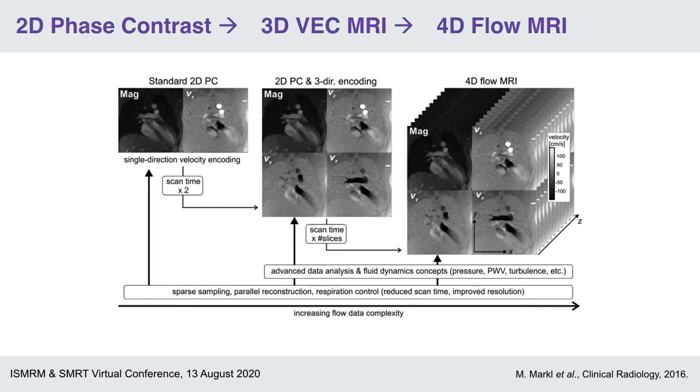And now we can get full 3D volumes of flow MRI, so that we can basically quantify blood flow at any location in a 3D volume.